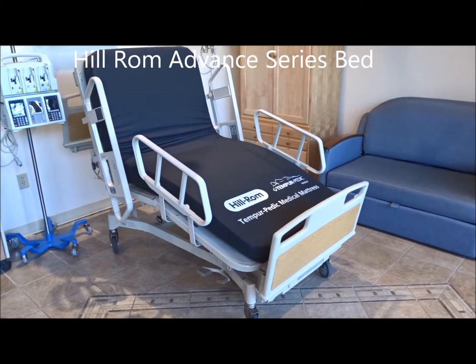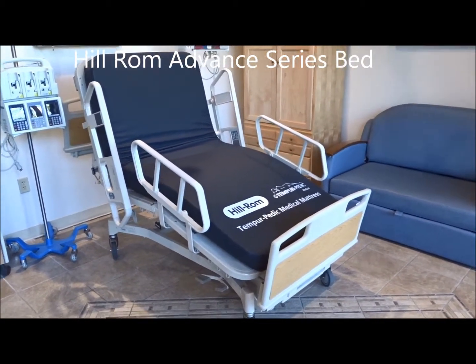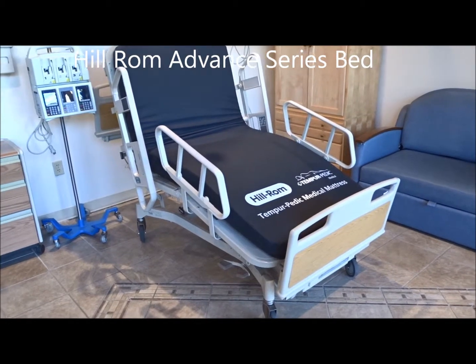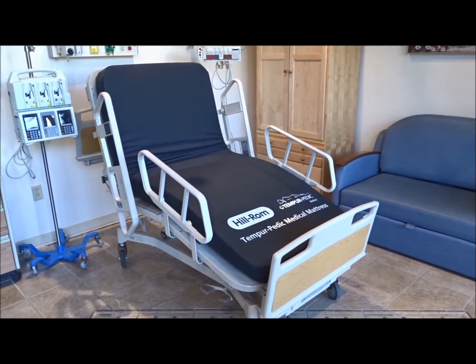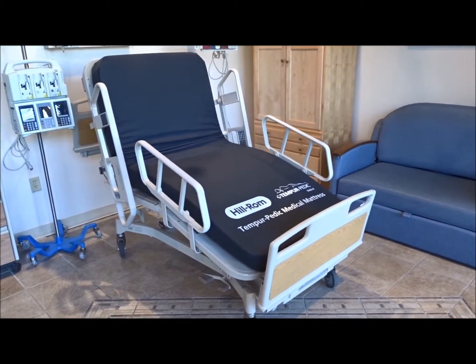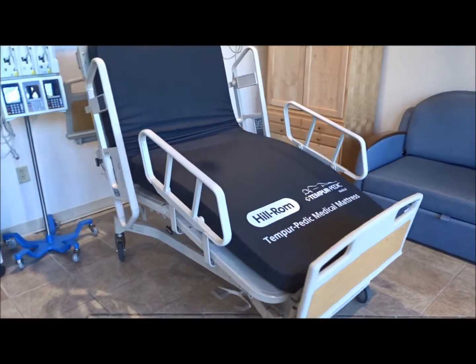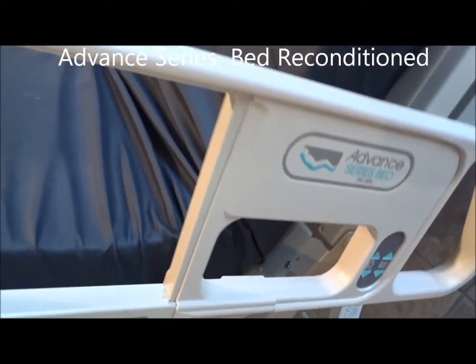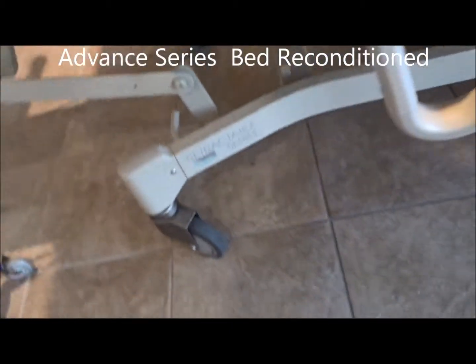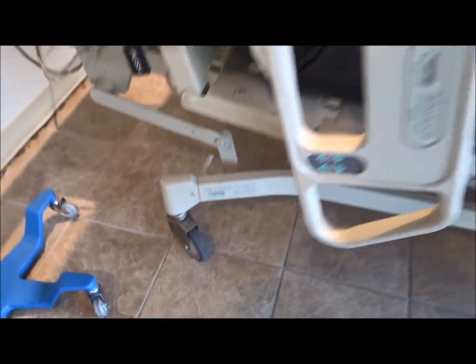We are looking at the Hillrom Advanced Series Hospital Bed, which is reconditioned. Basically the entire bed has been stripped down to the frame and then rebuilt. It's going to have brand new wheels, brand new cables, all brand new plastic on the rails, and all these parts here are going to be brand new, including new wheels and other parts down here as well.